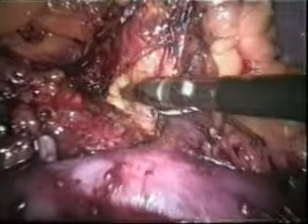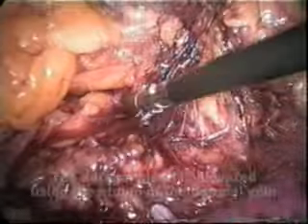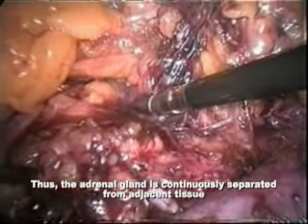It is useful to use the stump of the adrenal vein to elevate the adrenal gland itself. Thus, the adrenal gland can be continuously separated from adjacent tissue.